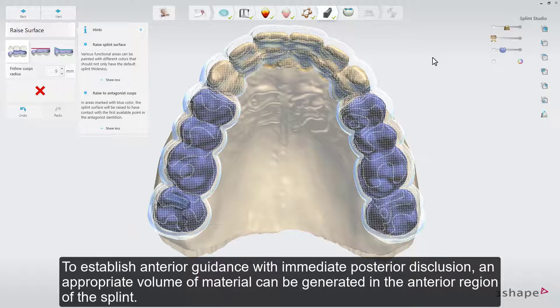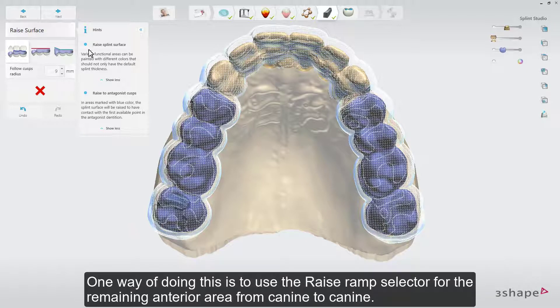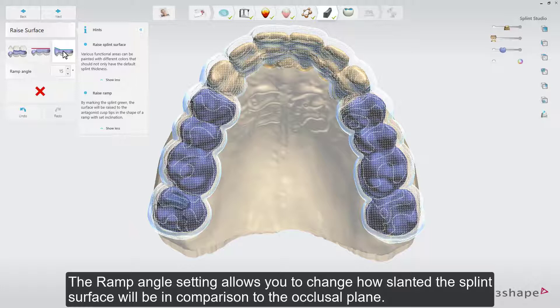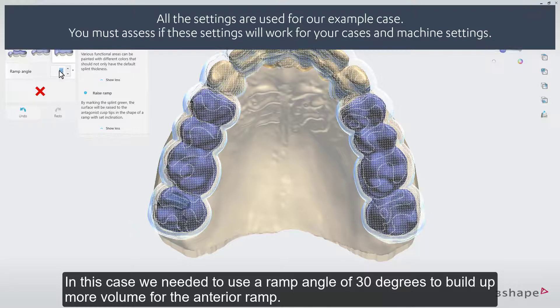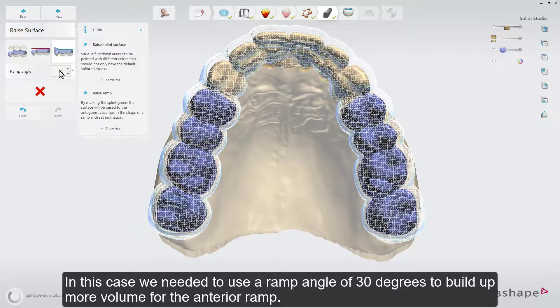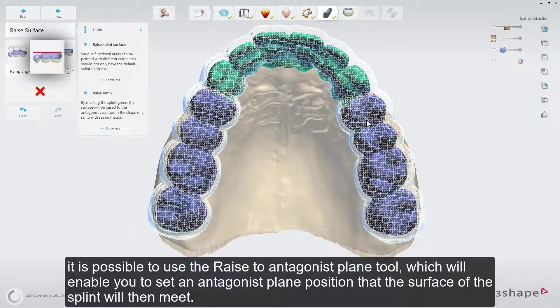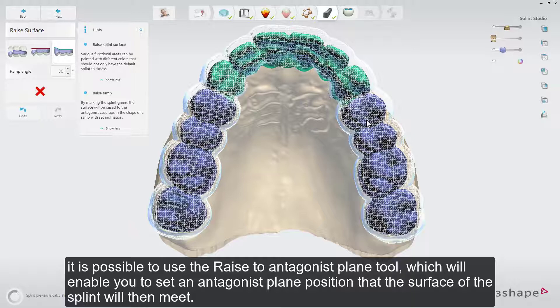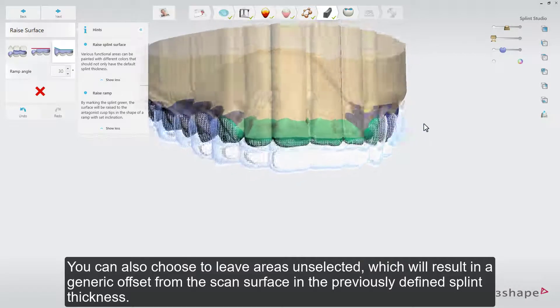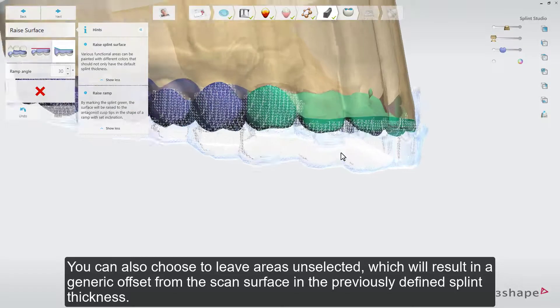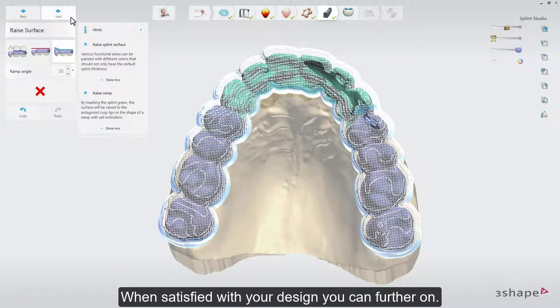To establish anterior guidance with immediate posterior disclusion, an appropriate volume of material can be generated in the anterior region of the splint. One way is to use the raised ramp selector for the remaining anterior area, from K9 to K9. The ramp angle setting allows you to change how slanted the splint surface will be in comparison to the occlusal plane. In this case we used a ramp angle of 30 degrees to build up more volume for the anterior ramp. If the raised ramp functionality does not produce the desired geometry, it is possible to use the raised to antagonist plane tool, which will enable you to set an antagonist plane position that the surface of the splint will then meet. You can also choose to leave areas unselected, which will result in a generic offset from the scan surface in the previously defined splint thickness.